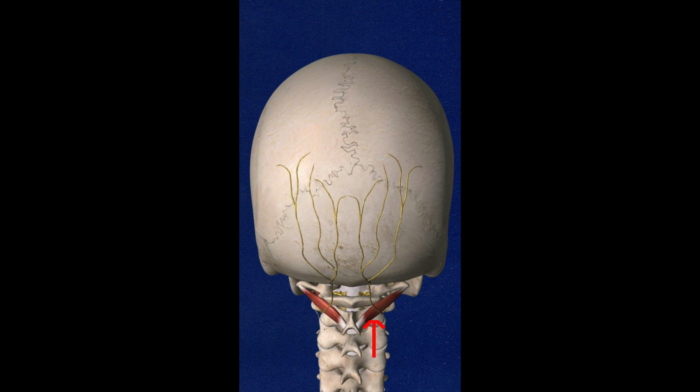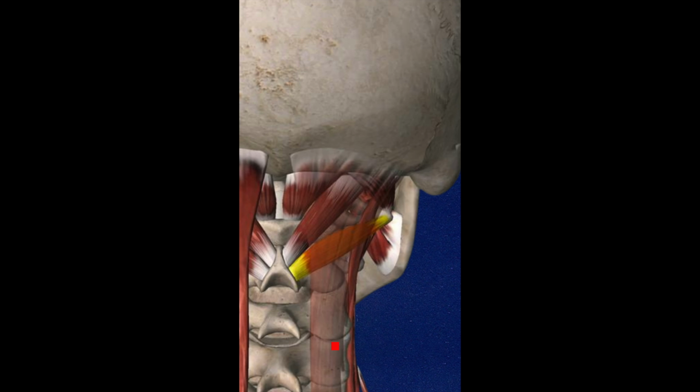Hence it's best targeted at a deeper plane where it's just coming off and going in between the two muscles, the oblique capitis inferior and the semispinalis capitis, as the chances of success there would be higher. Also, if you want to do a procedure like cryoablation or pulsed radiofrequency, then this is a more reliable, identifiable, targetable area which gives you better results.